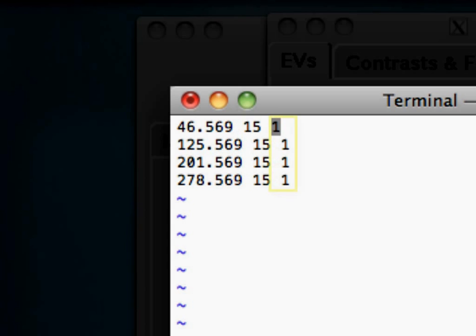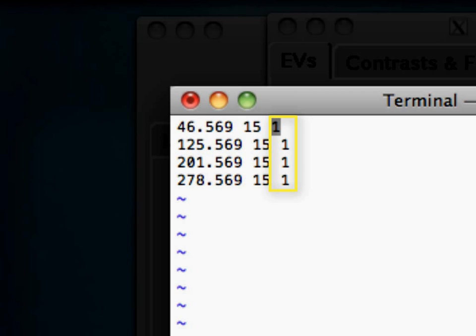Lastly, this third column will allow you to specify any sort of parametric modulation information. So, if there are any features about the condition or the stimulus that may have some parametric information that you think might be modulating the height of the BOLD signal, you can put that in there. For example, maybe you have luminance as some sort of parametric modulation that you think might be affecting your BOLD signal.